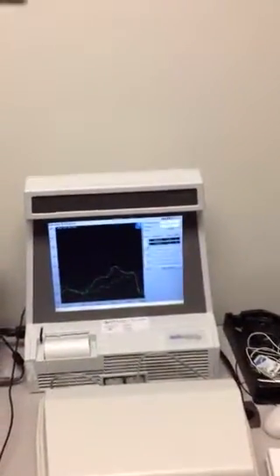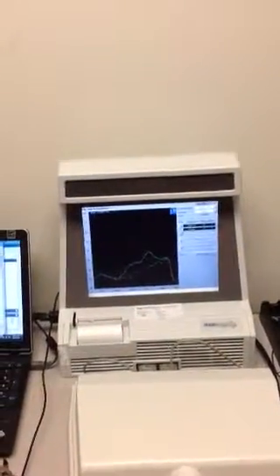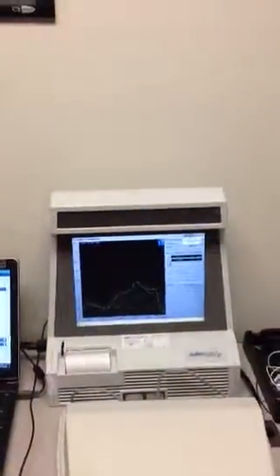It's on weak settings. This is actually defaulted to ultra zoom, so this would be the highest setting that Phonak could provide to us. So you would play around to see what the other settings look like. But at the highest setting, that is a good response.